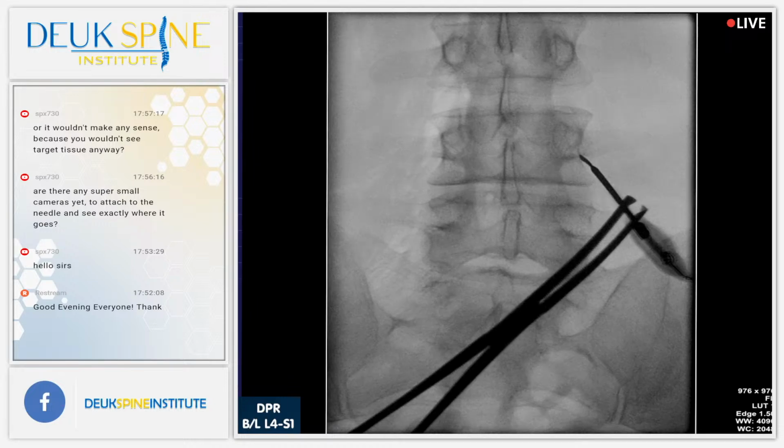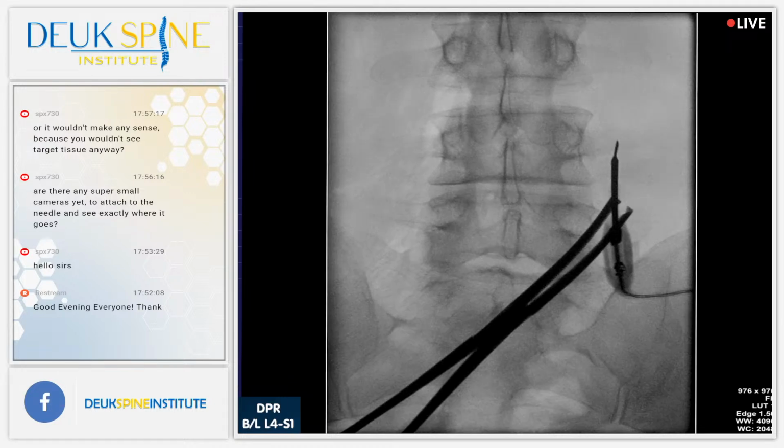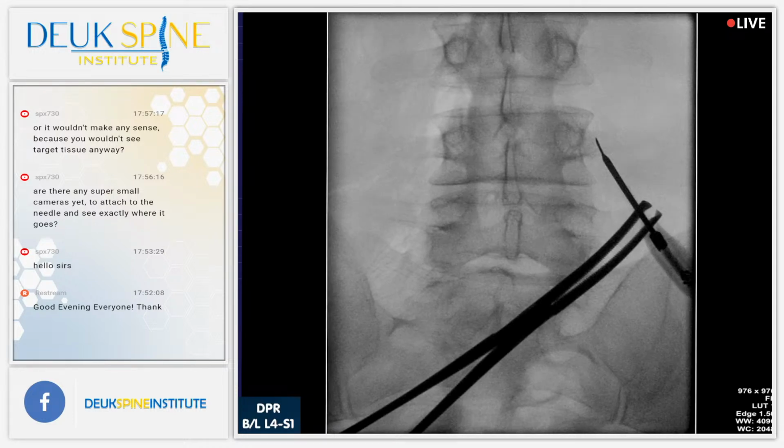Yeah. So I'm dancing around the facet joint, and what's interesting, shot, I'm on the TP, lateral, and I'm creeping medially, and I'm hitting right here. That's the exact spot I want to be. And so I'm going to paint this area with the bovie. All right, that's pretty good.